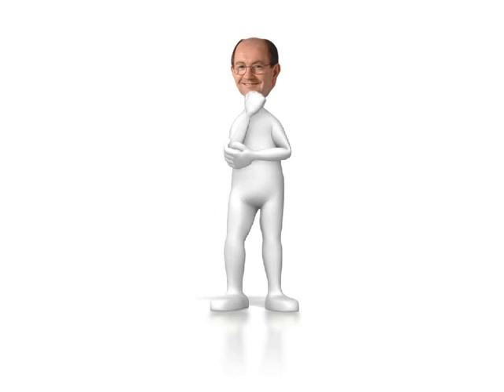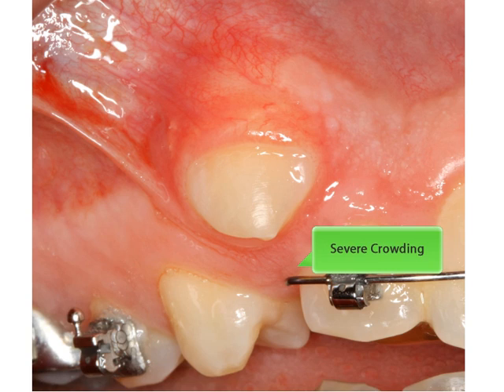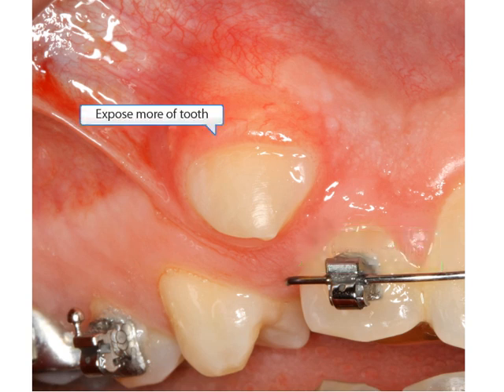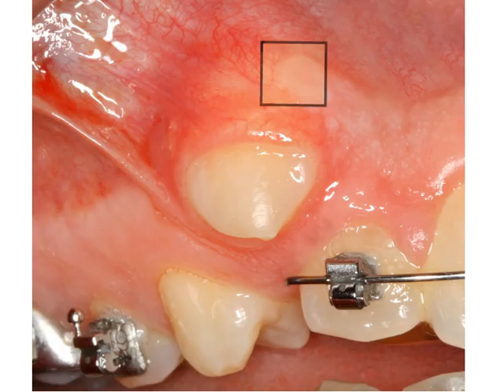So John O'Keefe, our Director of Knowledge Networks, asked me to create a clinical case for discussion. I posted this photo of tooth number 1-3 that's crowded out and misplaced to the buccal. I'd been asked to expose the tooth, attach a bracket and chain, and extract tooth number 1-4. There's little heavily keratinized tissue on the buccal aspect. You can see that it ends here and here.